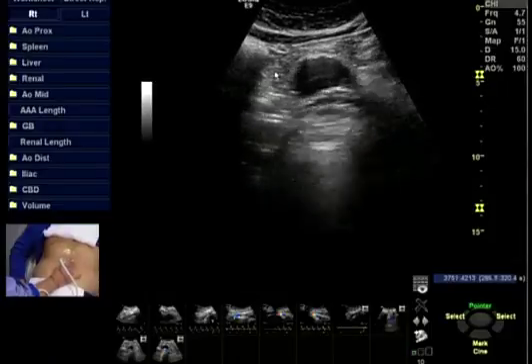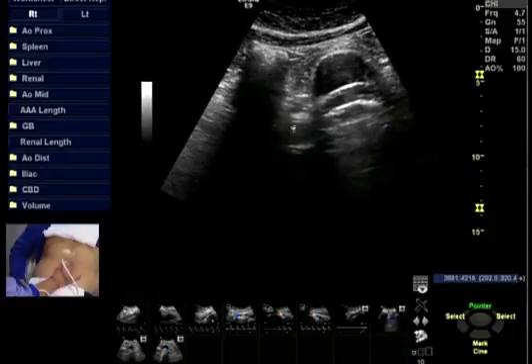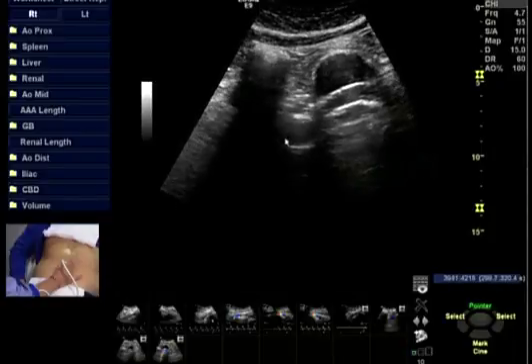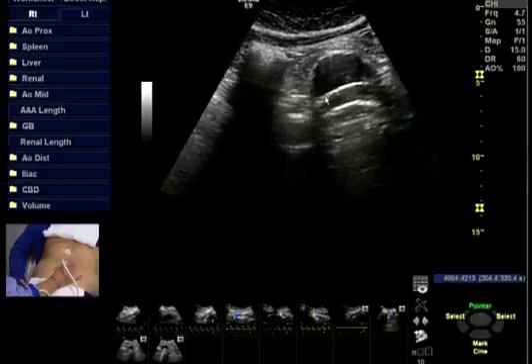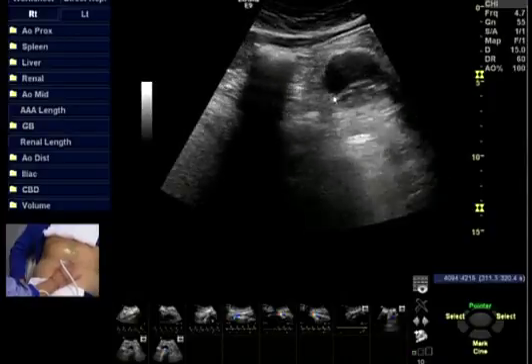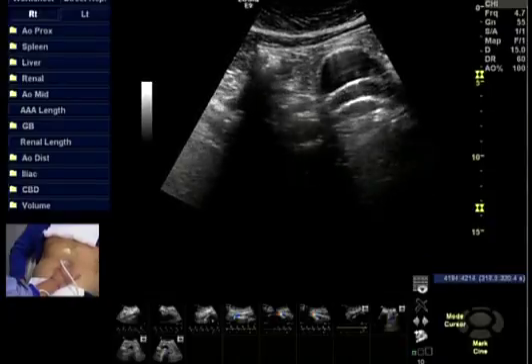And this is one of the considerations which went into the endovascular repair of this aneurysm when it reached a size of 5 centimeters. The other thing we now see in our long axis view is the tortuosity. We've got a relatively stiff endograft in place with an elastic vessel. So there's almost a discontinuity in the flow direction here, though there is a smooth transition from the main body of the graft to the two limbs of the graft. Where you see the bright echoes is where you really start to see the overlap of the modular characteristics of this graft.